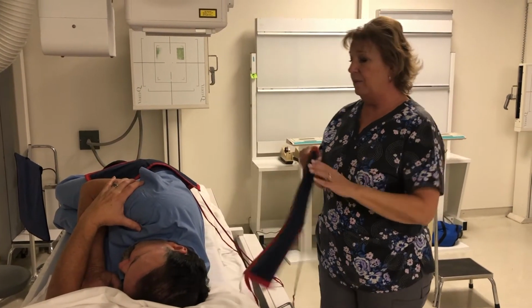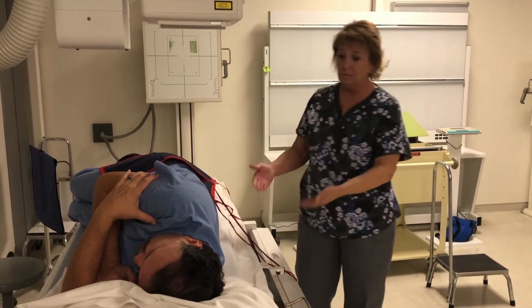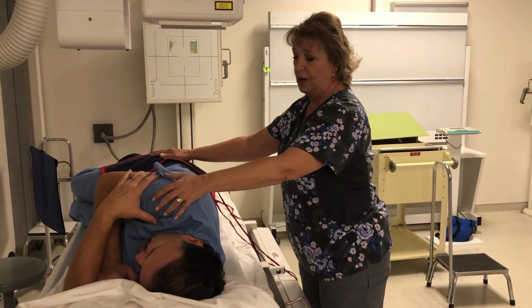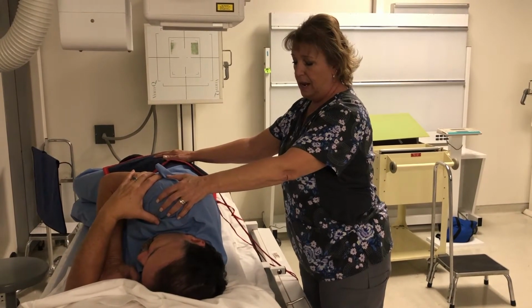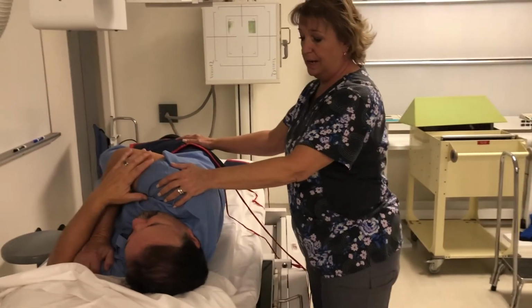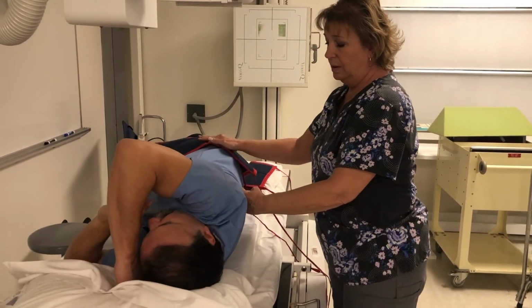All right, now if we were going to do obliques of the T-spine, our AP obliques are done by starting in the lateral position and having your patient roll back only about 20 degrees. It's a very slight roll.